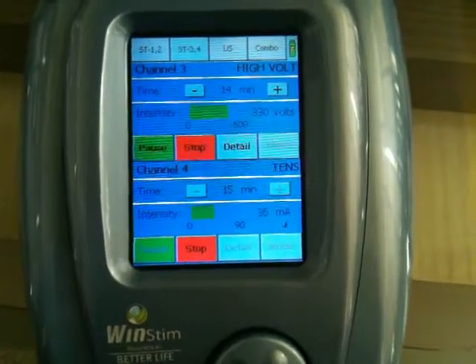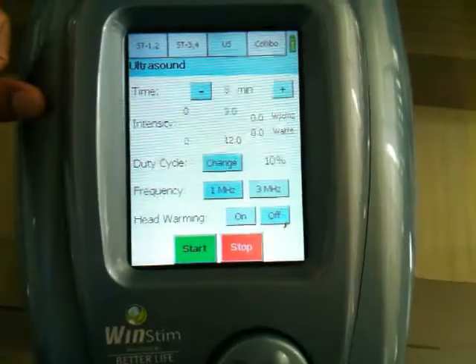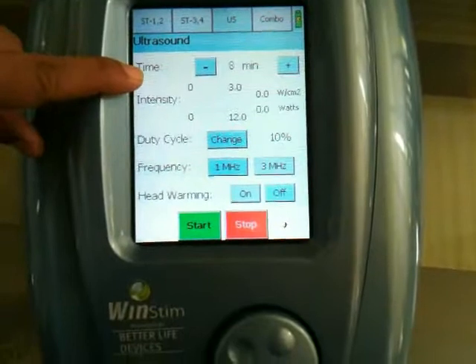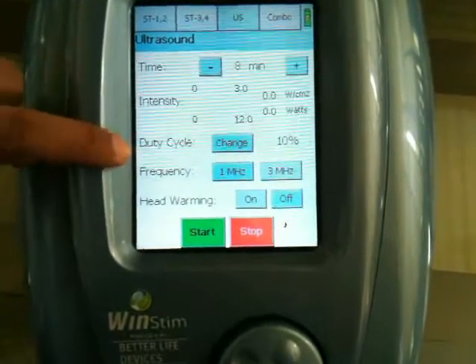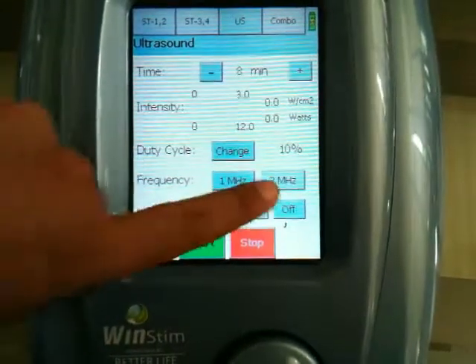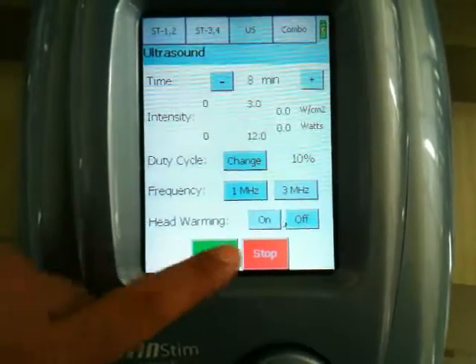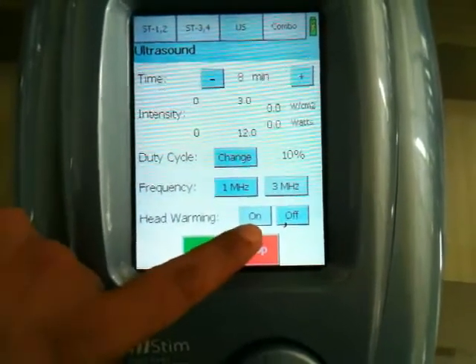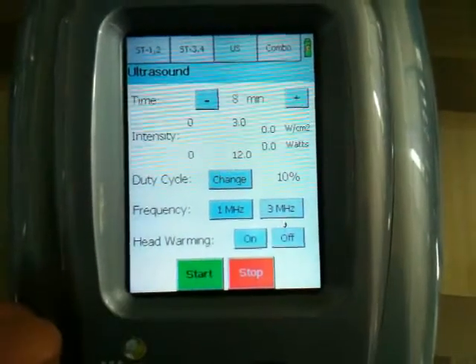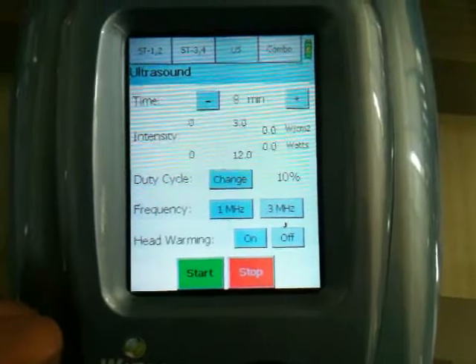Let's go to the ultrasound part of the unit. We can select the intensity and duty cycle. Frequency has 1 MHz and 3 MHz options. There is a great feature — the head warming function. We can make it on or off. It is recommended that if you are using the unit on battery, you should keep the head warming off.